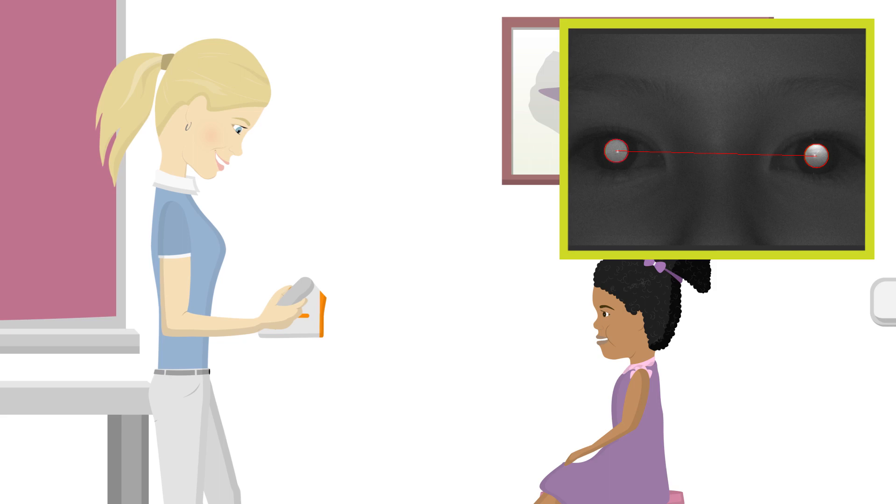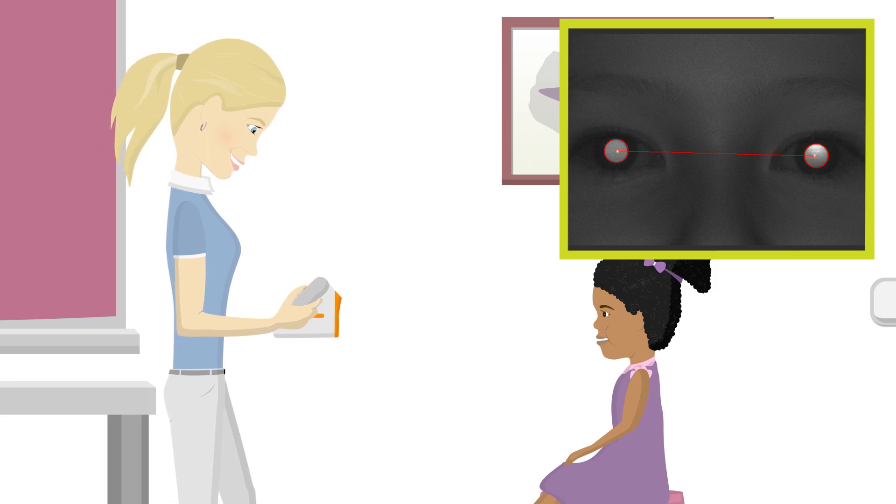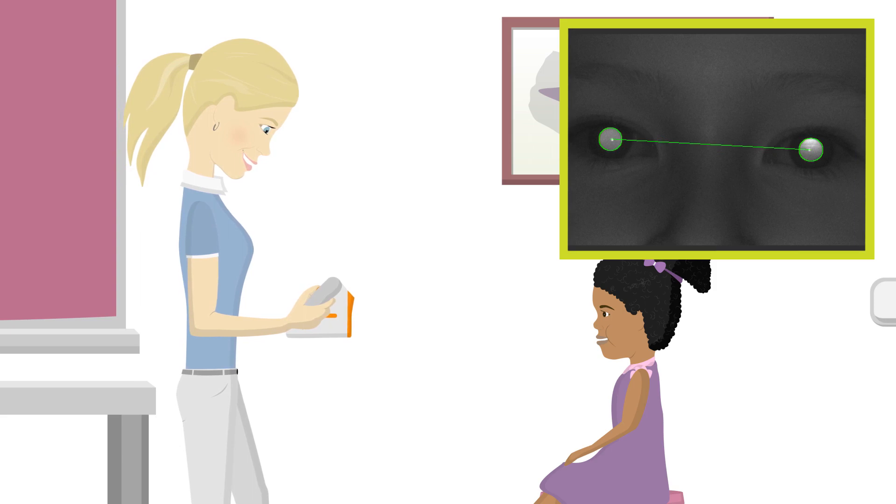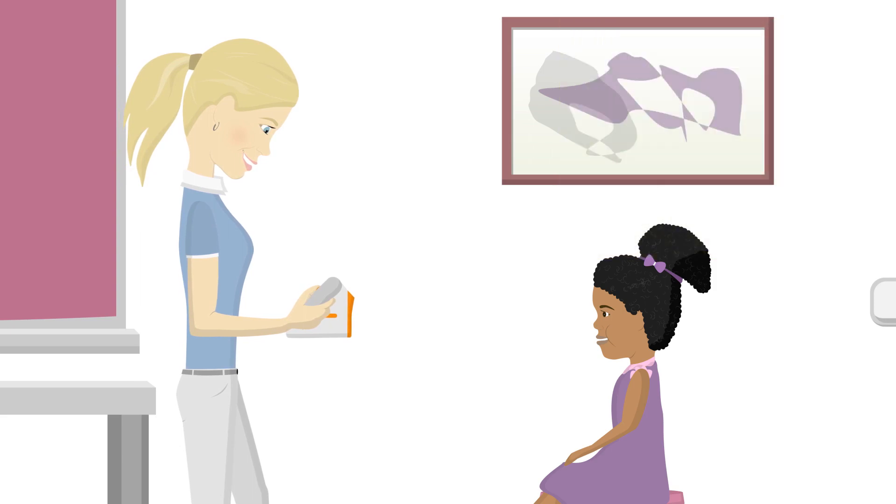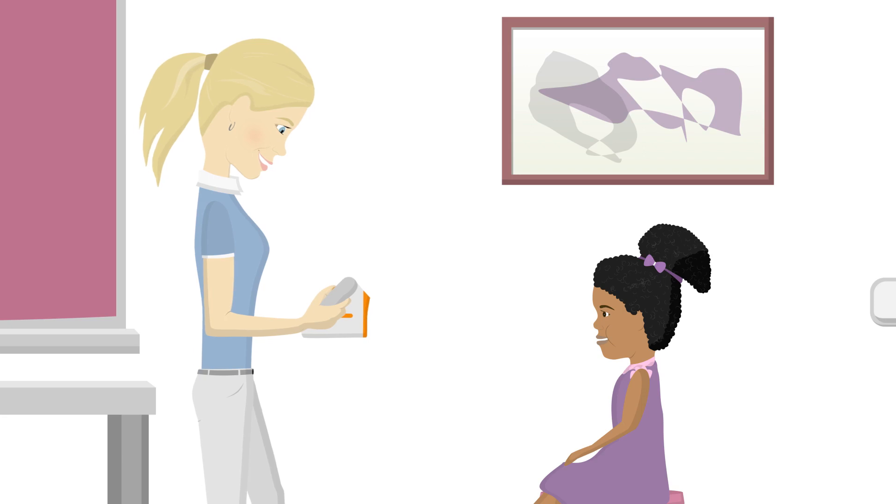Anna needs to continue in that direction until the red circles begin to turn green. Standing with one leg slightly in front of the other, as if riding a surfboard, allows Anna to easily rock forward or backward as necessary to obtain green circles around each pupil she sees on the screen.